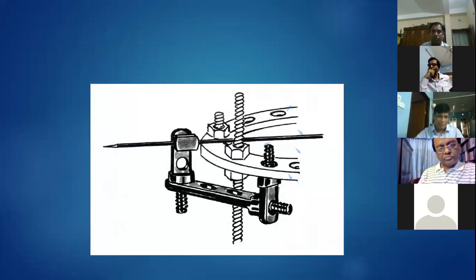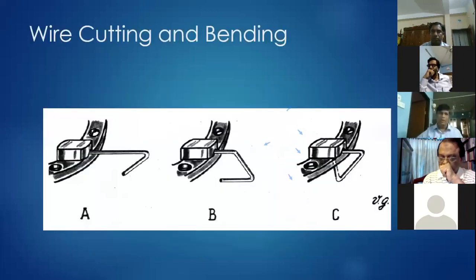In some cases, wire fixation must be performed away from the ring wall. In this situation, a combination of supports is introduced into the nearest available hole and is brought to the wire, but not vice versa.